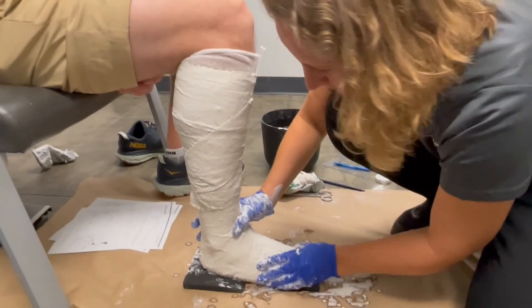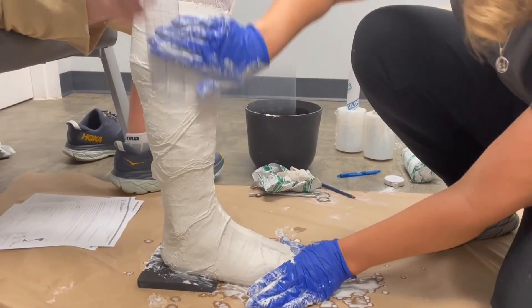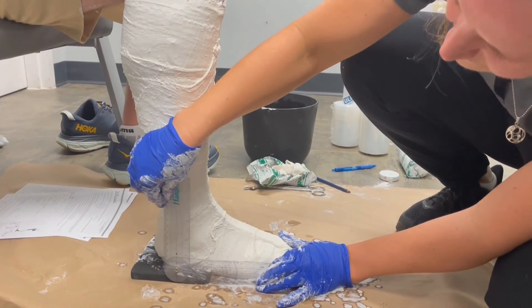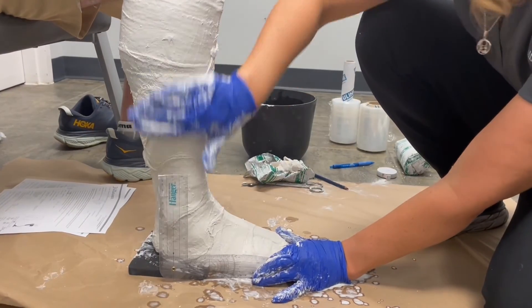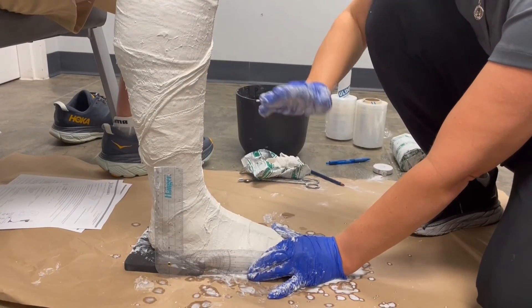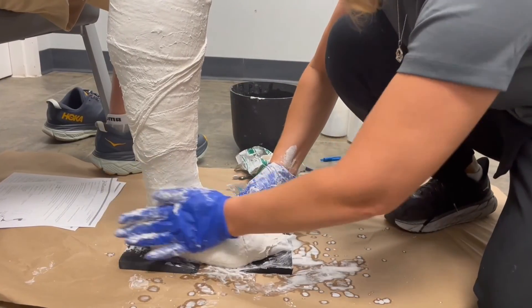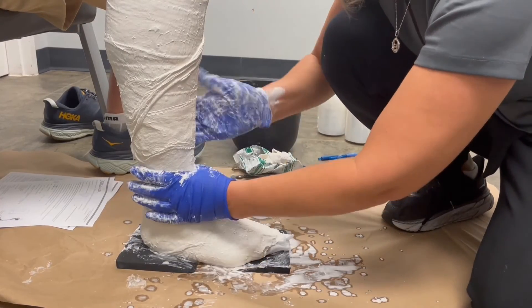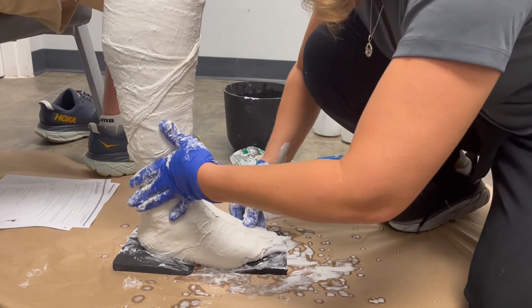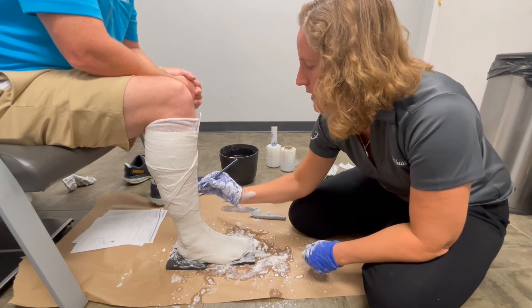Now I'm making sure the foot is held in neutral. This is extremely important to build the custom dynamic walk. I need it at 90 degrees in the sagittal plane, neutral in the frontal plane, and neutral in the transverse plane. Make sure you get it in neutral — it's extremely important to get a good brace. I'll mark here so I can get it back to the same position.